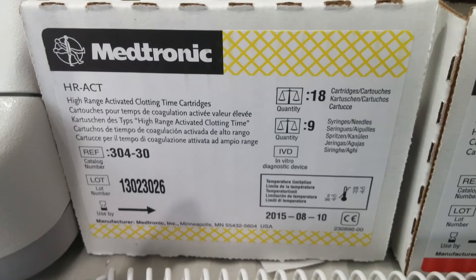You will also want to run a high range ACT. This cartridge works by using kaolin as an activator for factor 12. As with all of the other cartridges, the machine will raise the flags in the cartridge and, based on the resistance, will determine a point at which clotting has been achieved. In this case, the ACT is accurately calculated.